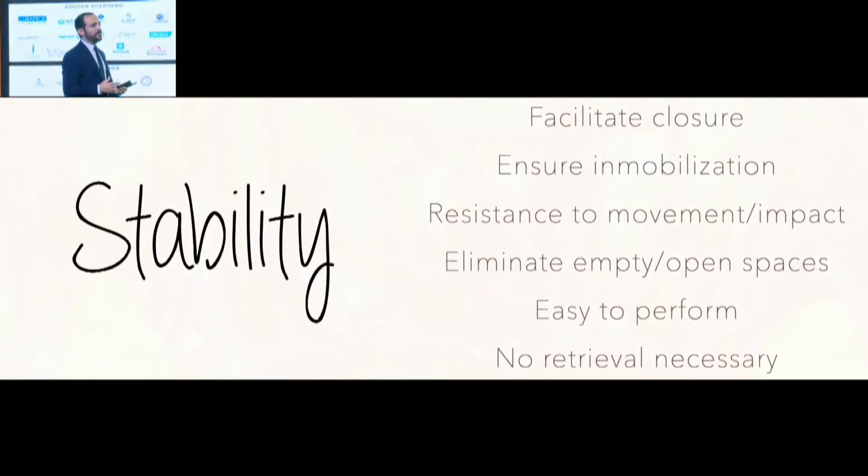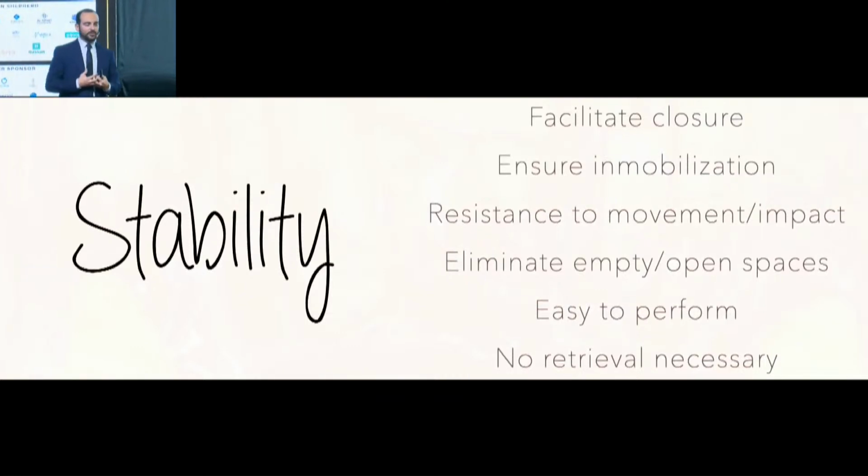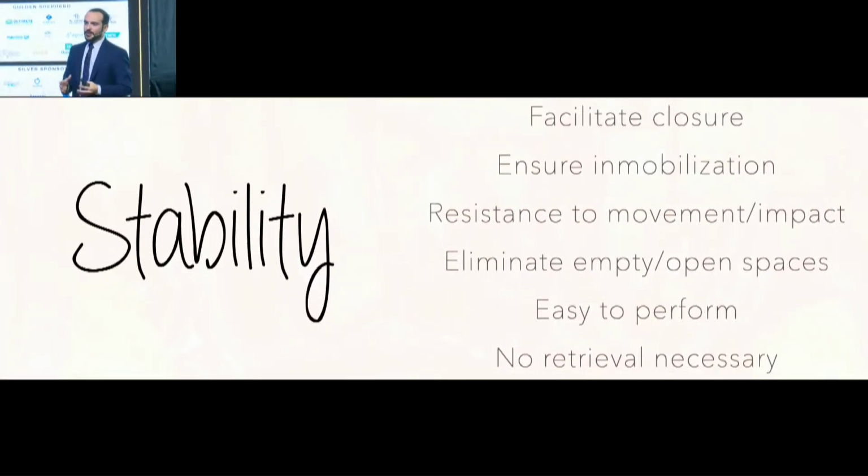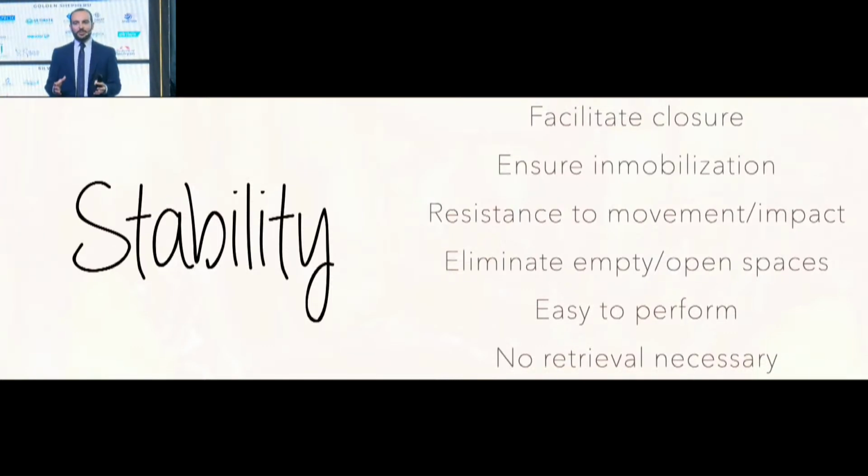I'm sure it has happened to most of you, and it happened in most of my surgeries at the beginning when I wasn't doing this procedure. We see the defect, take care of our soft tissues, place the grafting material, place the membrane, everything looking great. We take a couple of photos, and when we try to close the flap, everything is moving. We go back, we try to push the bone graft underneath, the membrane is moving, now the graft is no longer where we want it to be, the membrane is moving.